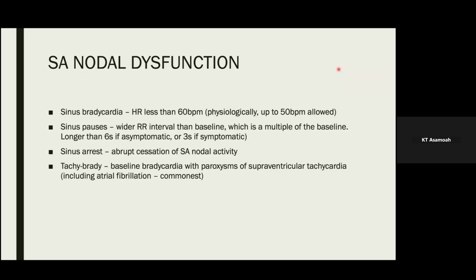Current guidelines suggest that for a pause to be significant, it should be more than 6 seconds. However, if it's more than 3 seconds and the person is symptomatic, then it is significant. And we've talked about sinus arrest.